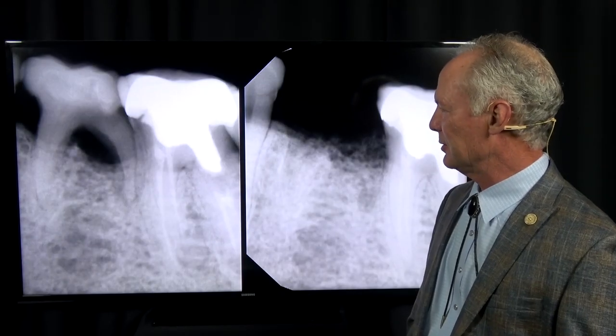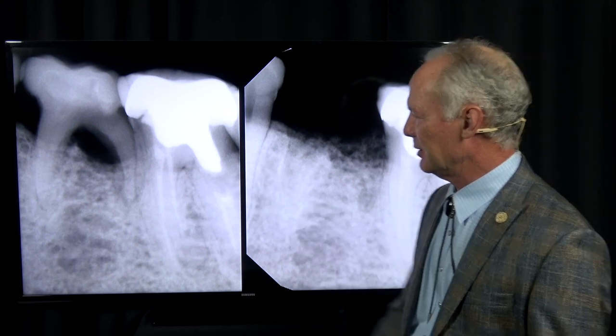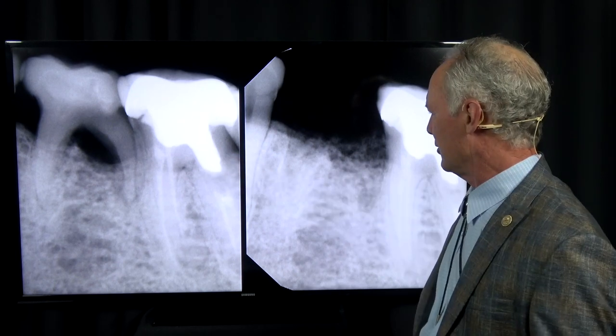We've got an abscessed deciduous first molar in a woman who is about 70 years old. You can see the abscess right here. So we're extracting the tooth and bone grafting it.